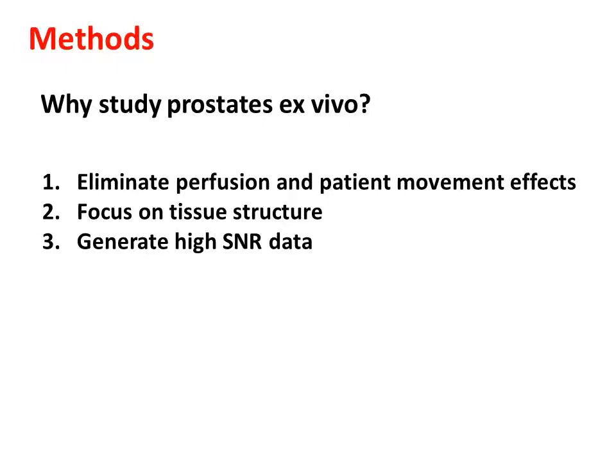So why are we looking at prostates ex vivo? Well, we can eliminate the perfusion and patient movement effects and focus our study on the tissue structure.